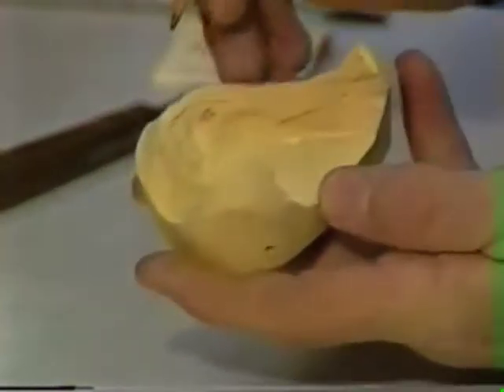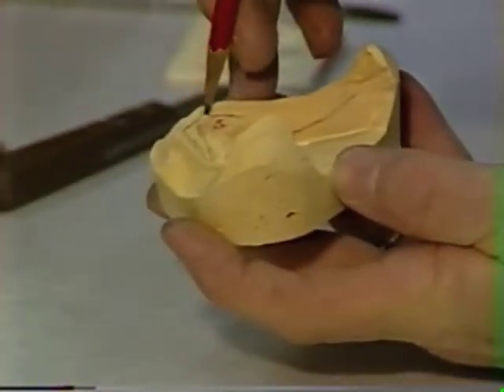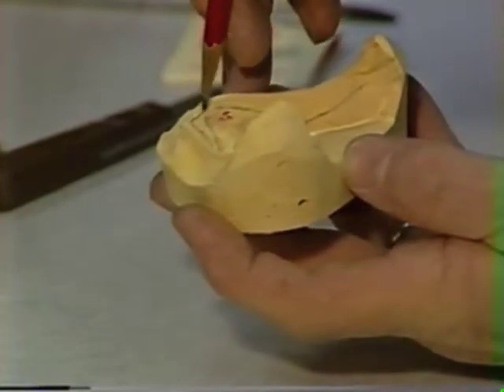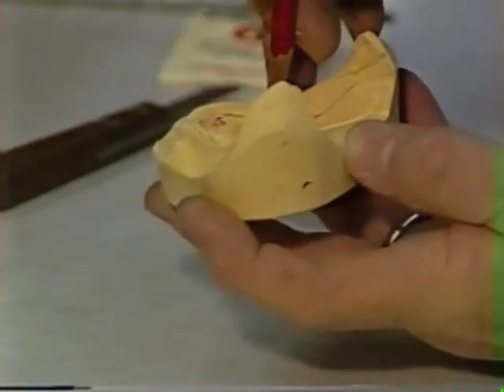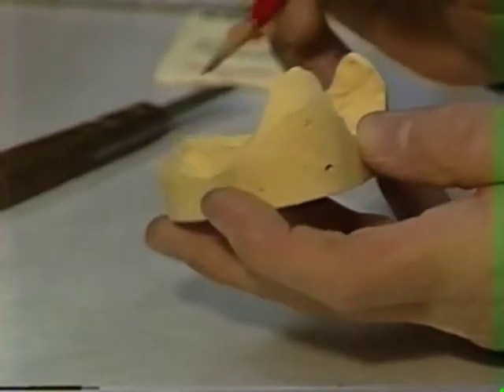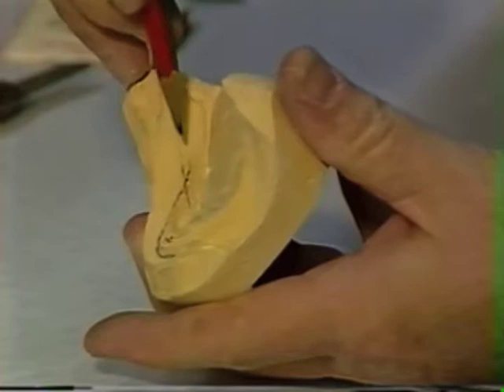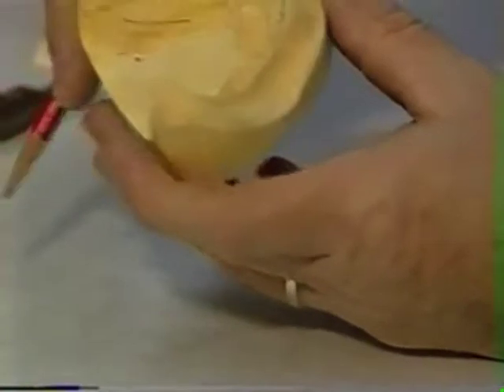Now what we're going to do is outline our tray so that it starts at the depth in the midline around here, and it's going to stay above the mylohyoid ridge until you get to the area of about the first molar. It's going to remain almost in the same plane as you started out, fairly well paralleling the horizontal portion of the crest of the ridge. And that tray now is going to come along and cross the mylohyoid ridge in about the first molar area, and continue on back into infinity. Let's do the same thing on the other side now.